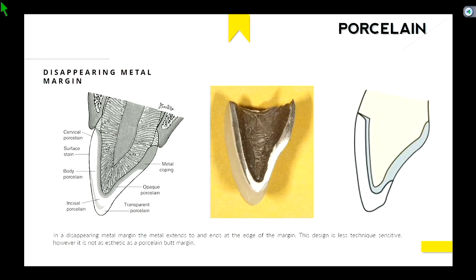For an anterior tooth, you may want to stick to a porcelain butt margin because it's the most aesthetic margin that we have for these PFMs. Okay? So just a difference between the two.